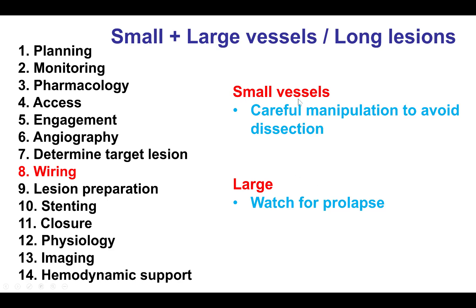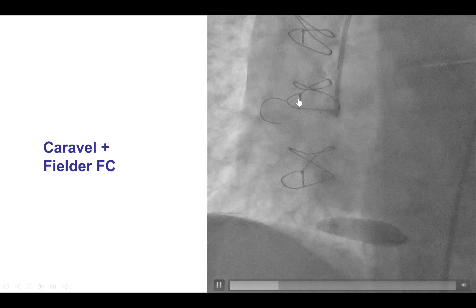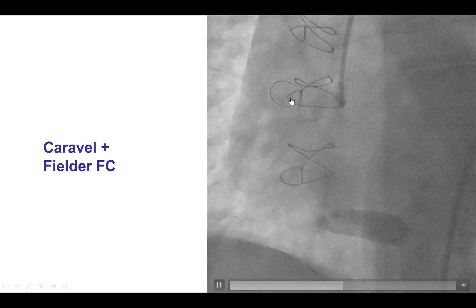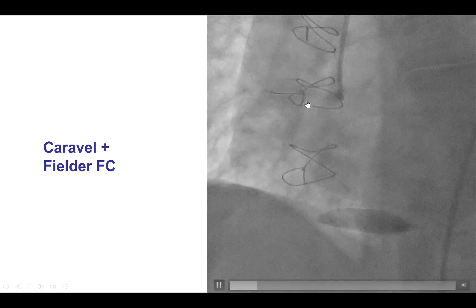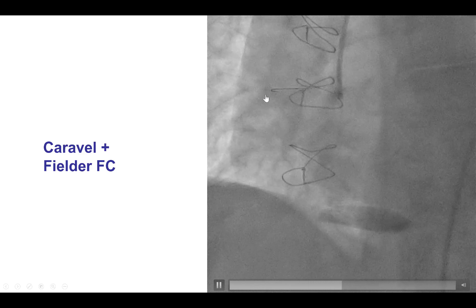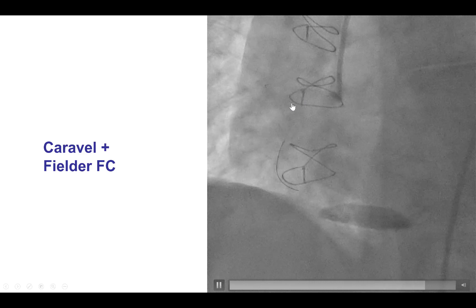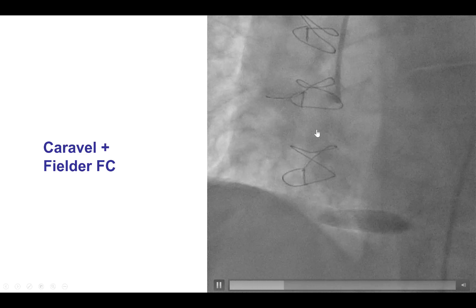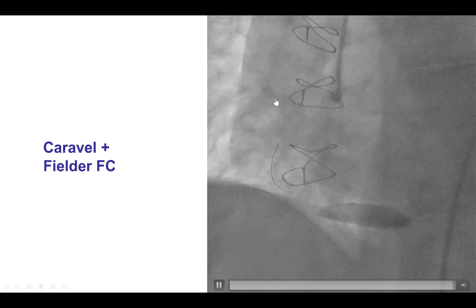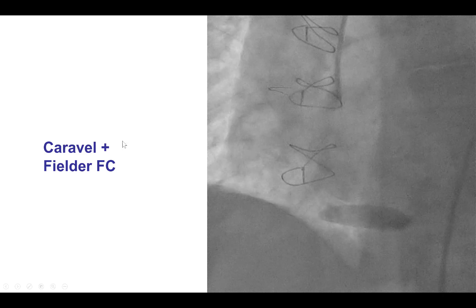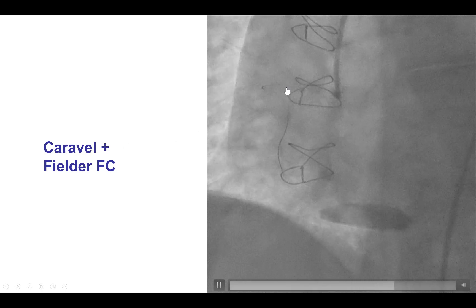In terms of wiring, for small vessels, workhorse wires are usually used and carefully advanced to minimize the risk of dissection. In large vessels, sometimes the wires tend to prolapse. This is wiring through the previously shown aneurysm of the proximal right coronary artery — the wire tends to coil inside the aneurysm. However, a polymer-jacketed wire along with a microcatheter was successfully used to reach the distal right coronary artery. For larger vessels, larger bends may be needed in the tip of the wire, as well as use of a microcatheter such as the Caravelle, Corsair, Turnpike, or an angulated microcatheter.